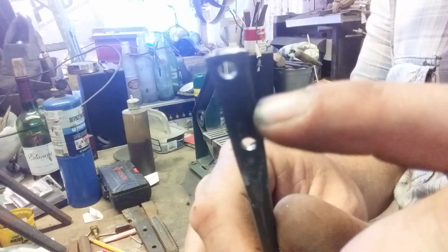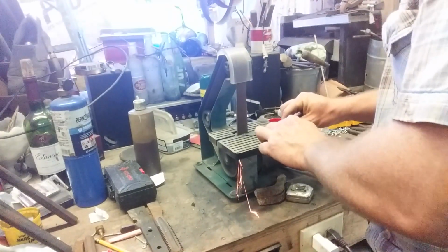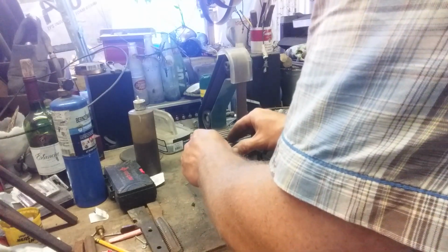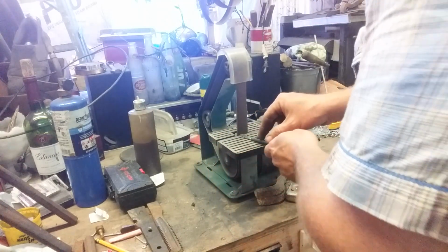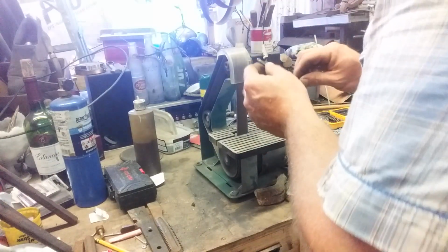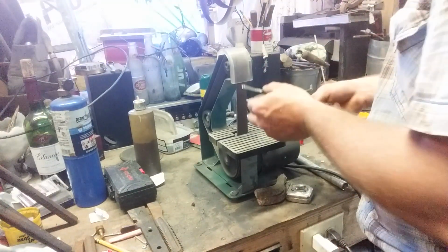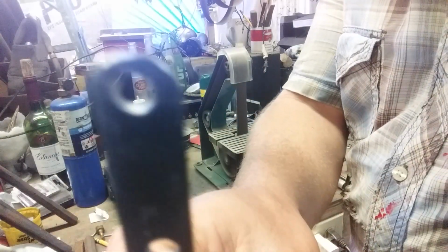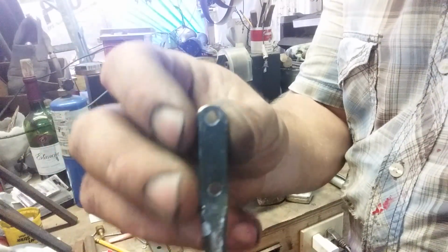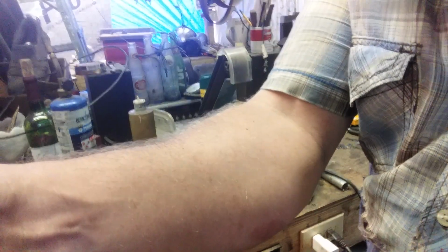I need to kind of bullnose these out, nice and rounded and deburred. I'm going to do that to all of these, and we'll cut off the little links and do it to them. See you in a minute.